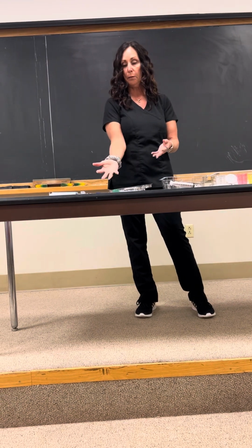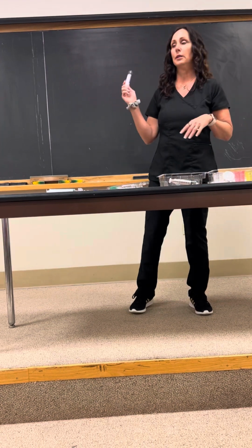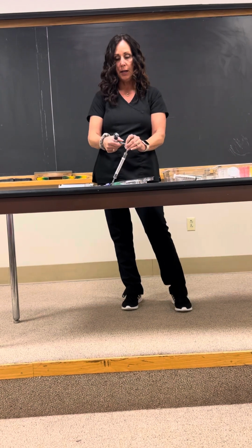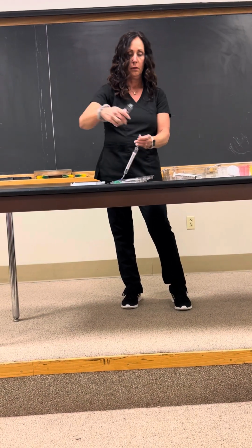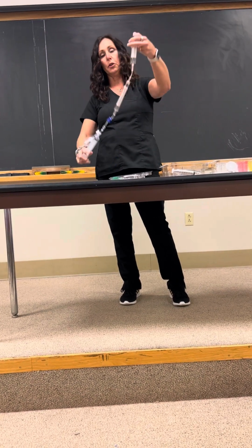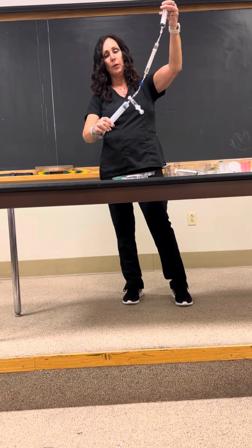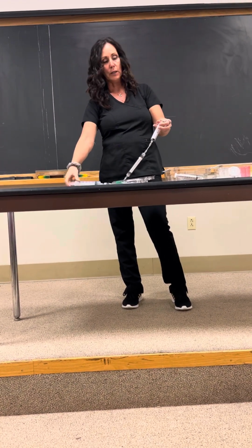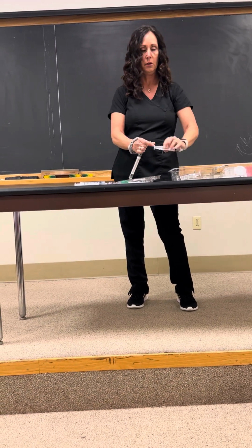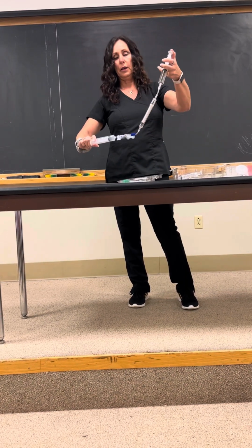Once the surgeon's ready, they will take the bone marrow needle and harvest their marrow, one syringe at a time. They'll hand off the 30, and all you're going to do is take that from the surgeon, connect it to your filter, and gently push it through, and at the same time, you can start pulling on your 60. It'll just go right through that filter into the 60. Once this is empty, just disconnect that. You'll be given that second syringe that has marrow. Go ahead and connect that as well, and then push that through.